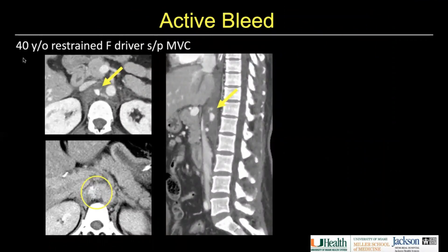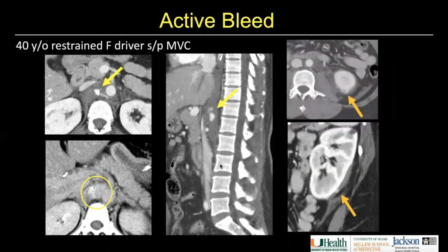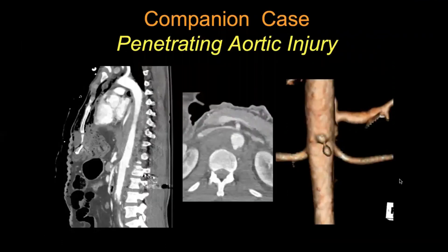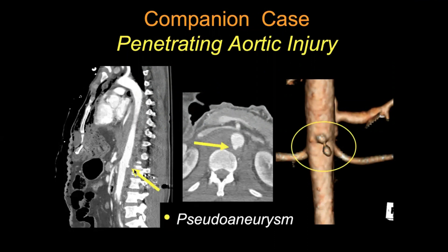In a different case of status post MVA, there is active bleed in the retroaortic region, periaortic. Note on the delayed images how it changes morphology and increases in size. This patient was embolized and additionally had a left lower pole laceration with a small amount of active bleed and perirenal hematoma. A companion case with a gunshot wound in the retroperitoneum with an aortic pseudoaneurysm and retroperitoneal hematoma treated with endovascular repair.